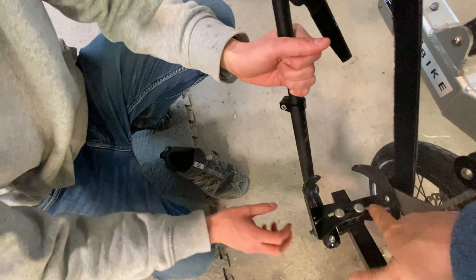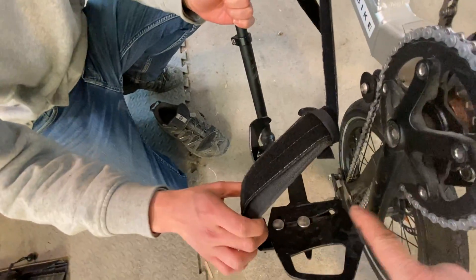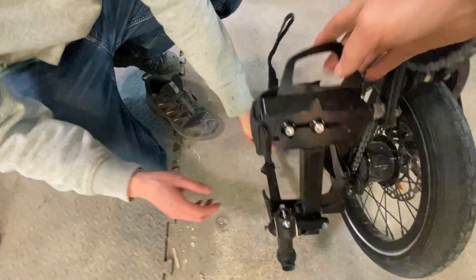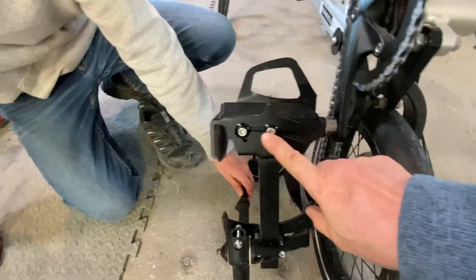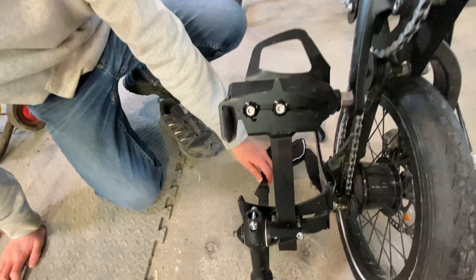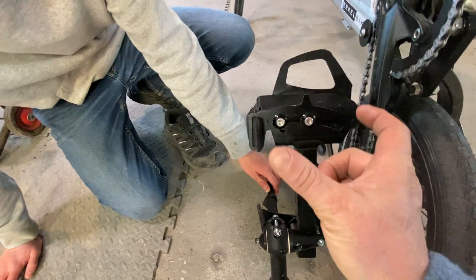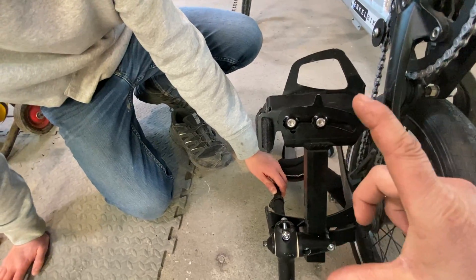You would adjust the width in the back and the width in the front, and you can do that with these Allen wrenches — they're 5mm Allen wrenches. You can adjust the angle, the width, and the length of this pedal.